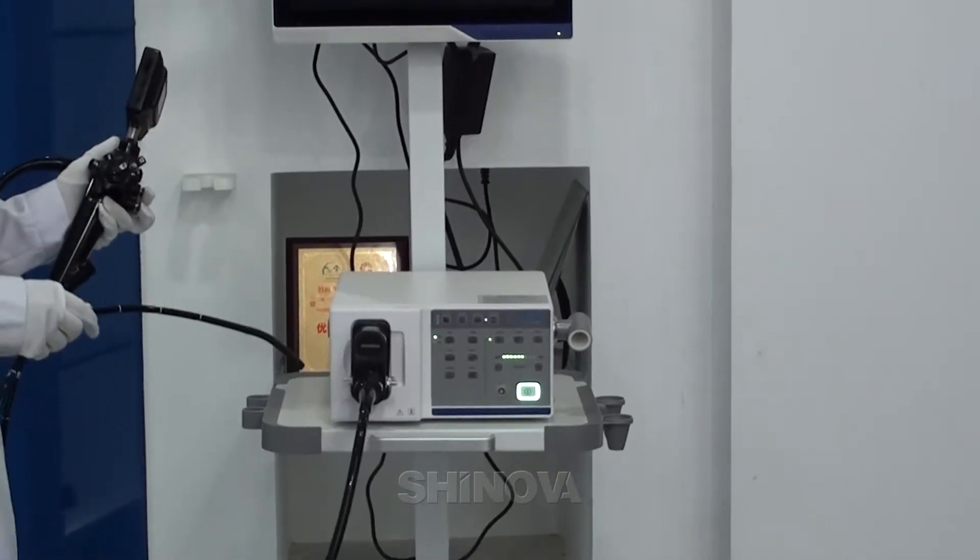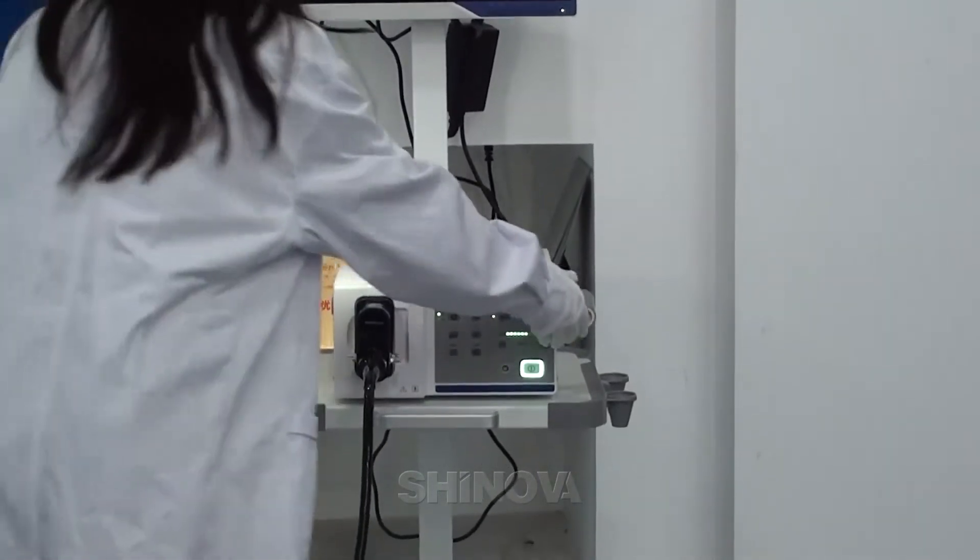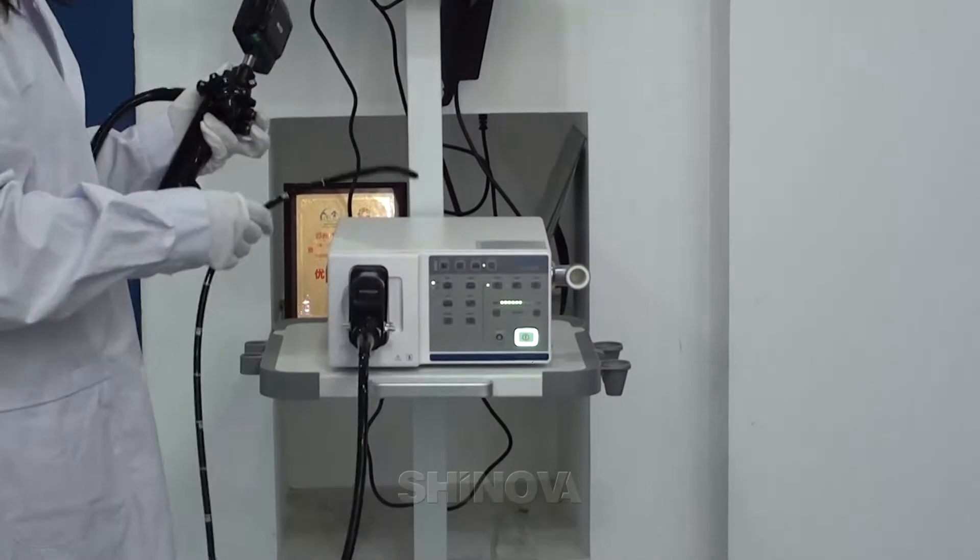First of all, when we start the procedure, we need to do the white balance like this.